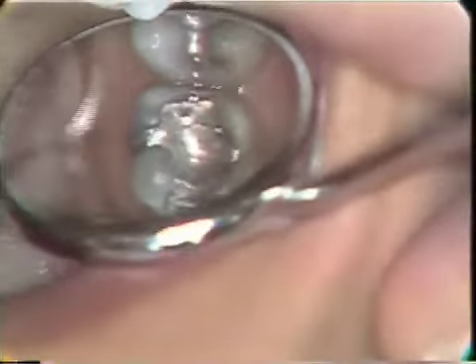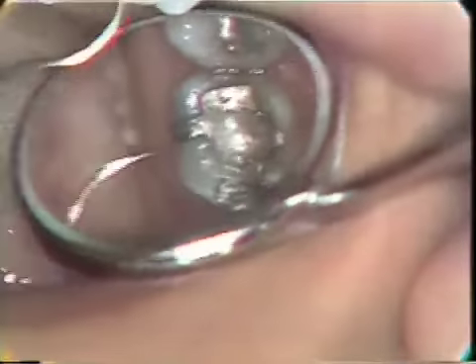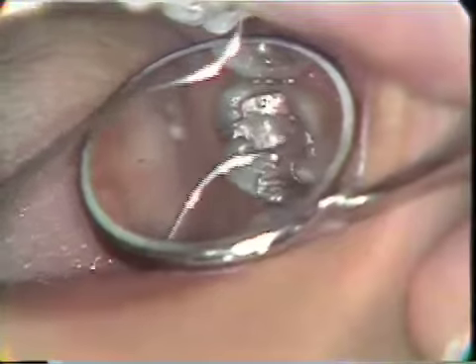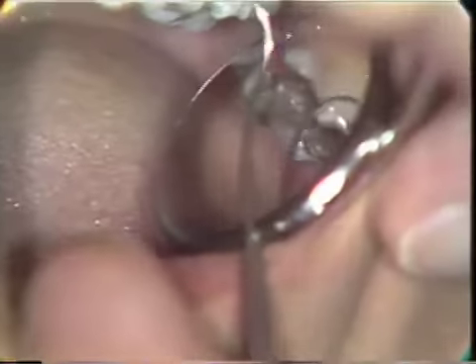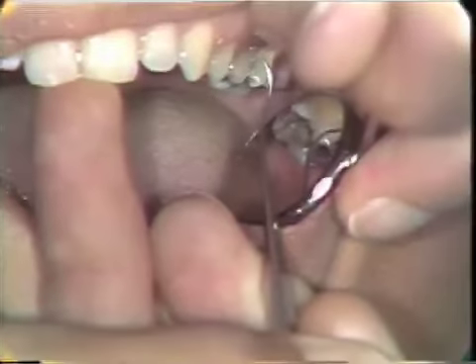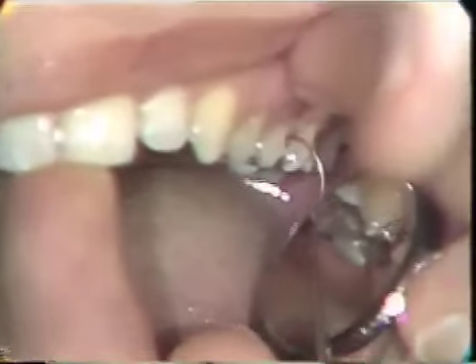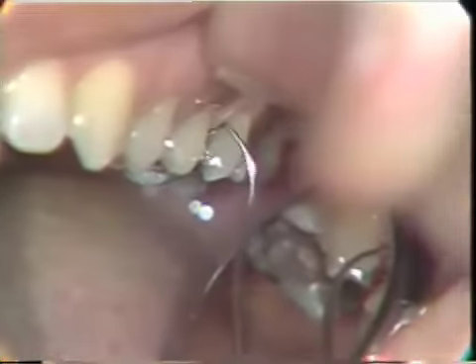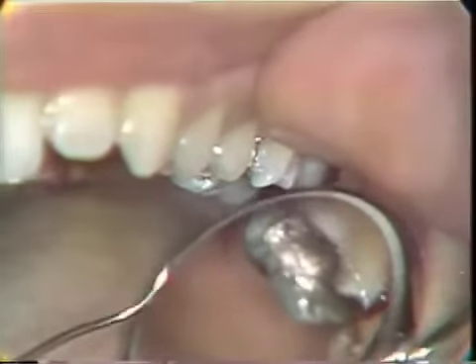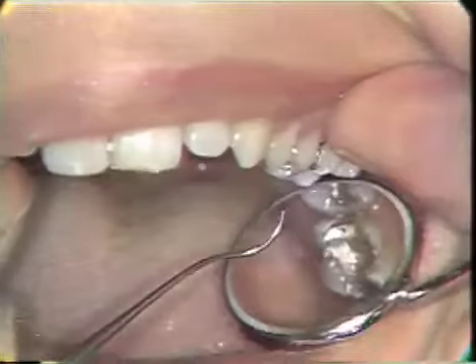Number 14 has a large amalgam restoration, which appears to be acceptable. It has a rounded out anatomy but otherwise appears to be successful. If we check the mesial cervical, there is a slight excess. Coming up on the restoration, the explorer stops. It catches on that slight excess. That could be removed with a number 12B scalpel.